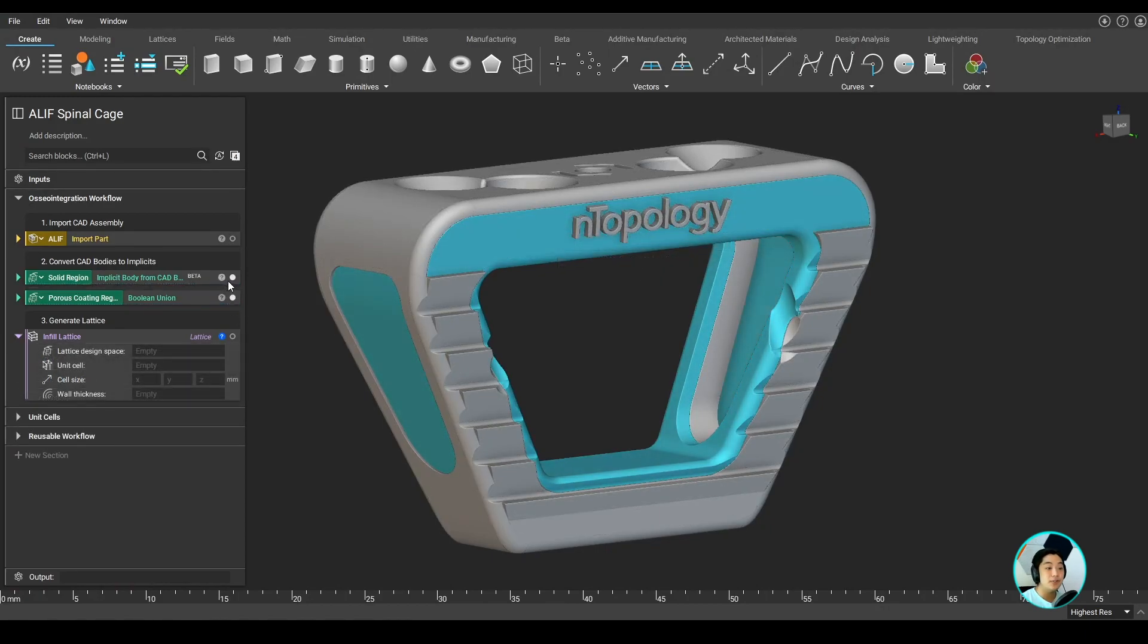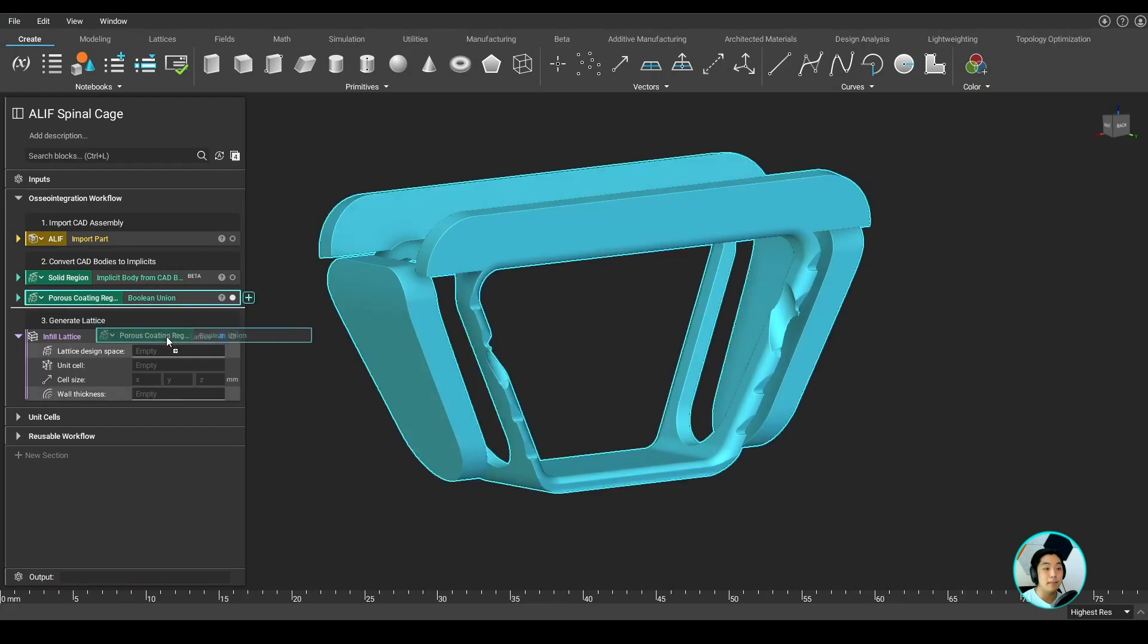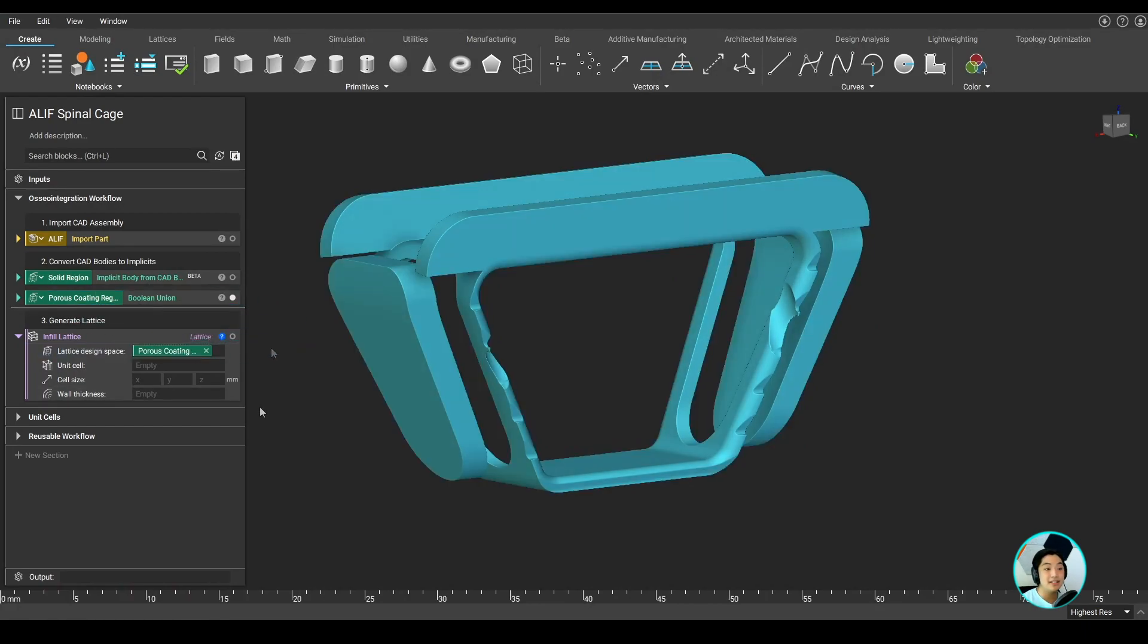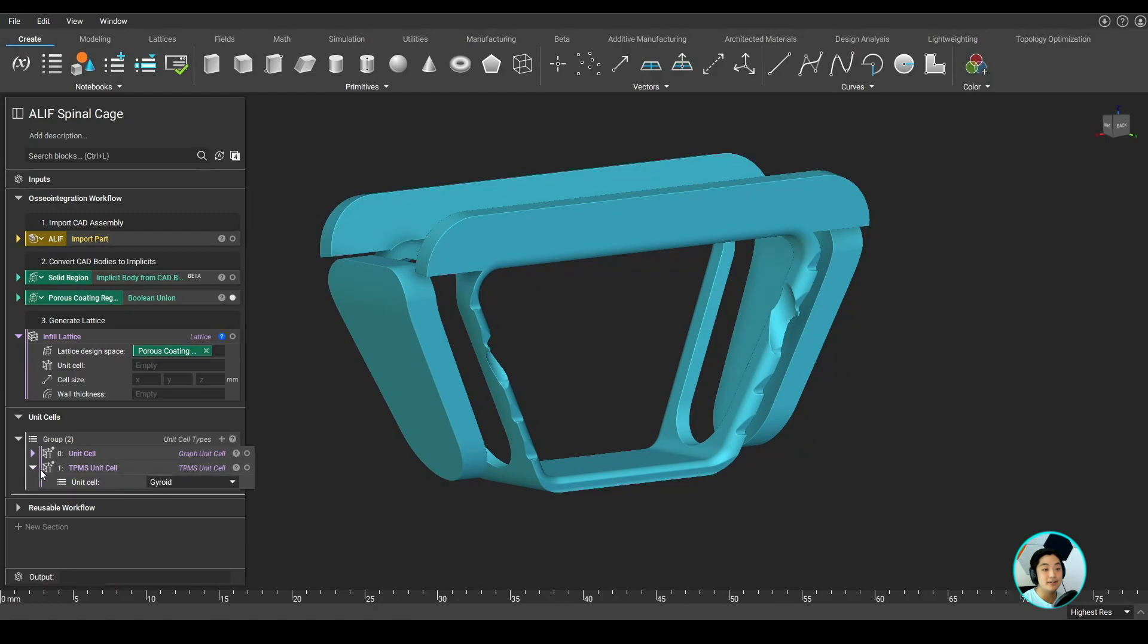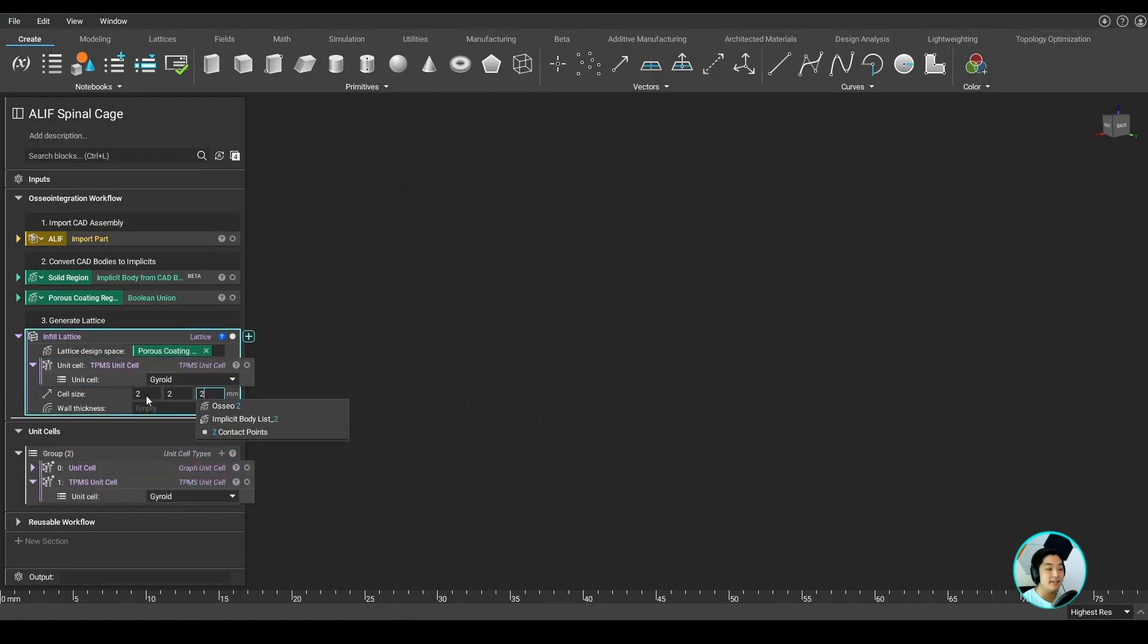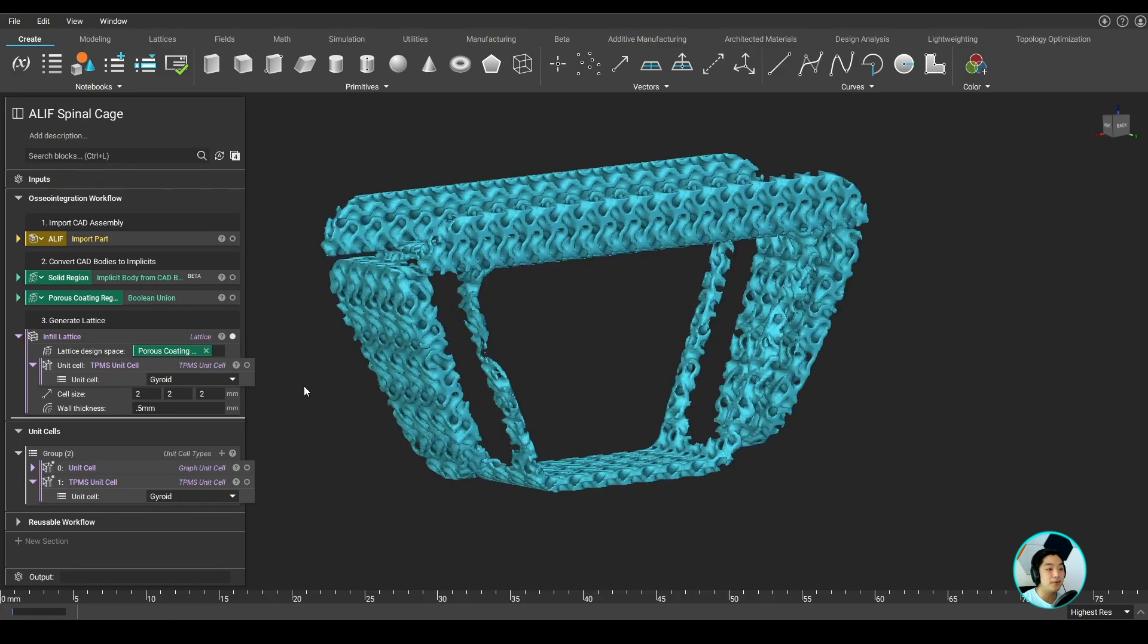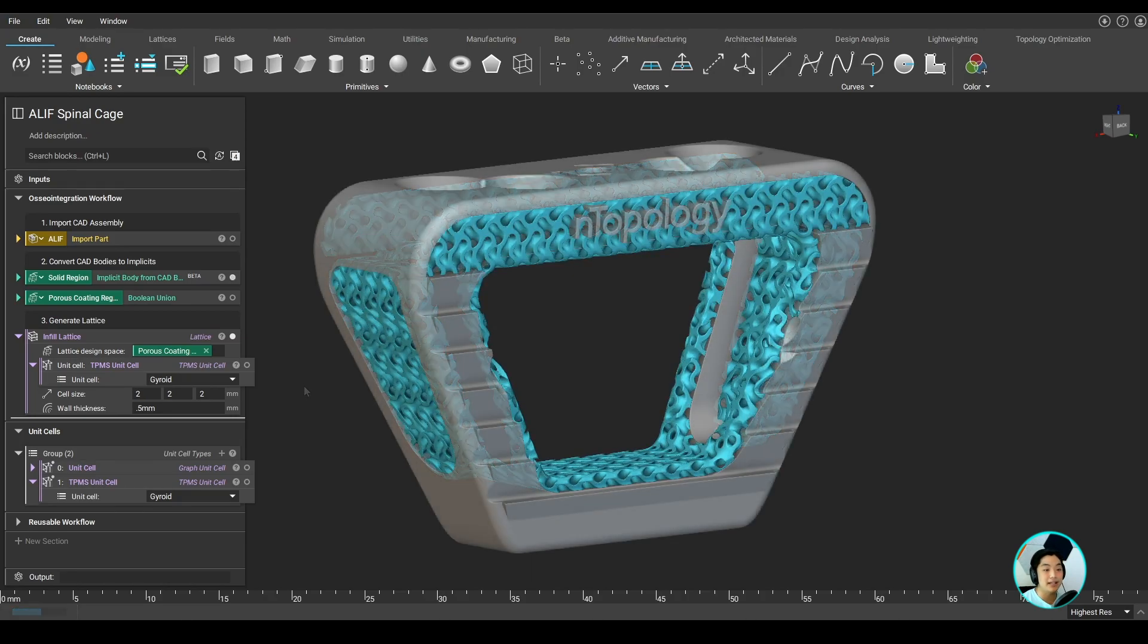First, I indicate which region I want to fill with lattice. In this case, I'll be dragging my porous coating region. I can then select a unit cell I want to use. In this case, I'll use a gyroid unit cell. I can then specify my cell size and my wall thickness. And just like that, I have created a gyroid lattice as my porous coating.